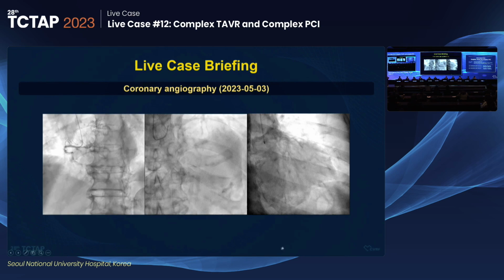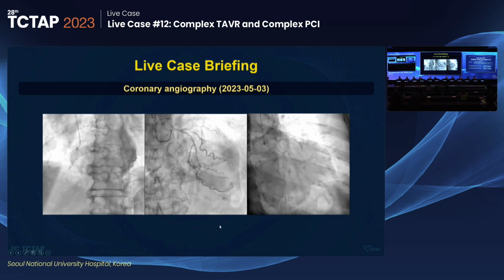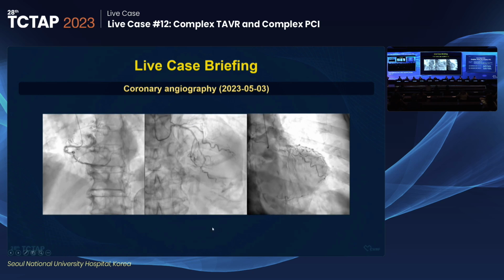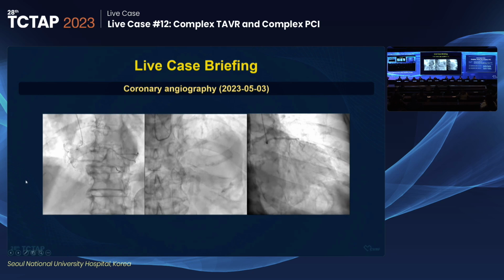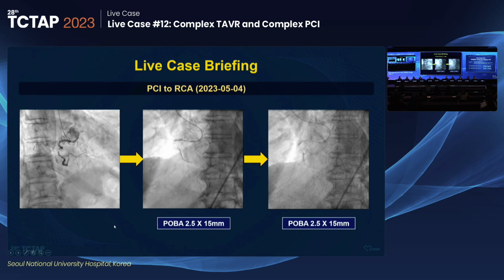Just last week, Dr. Hwang treated RCA again. Angiogram shows restenosis of mid-RCA treated with balloon. Patent stent at proximal RCA. Left coronary artery is no change. Dr. Hwang treated the mid-RCA recurrent lesions. It was very difficult to advance. Thus, he first fully inflated the proximal stent, then he was able to reach the balloon to mid-RCA after the tortuous calcified RCA.